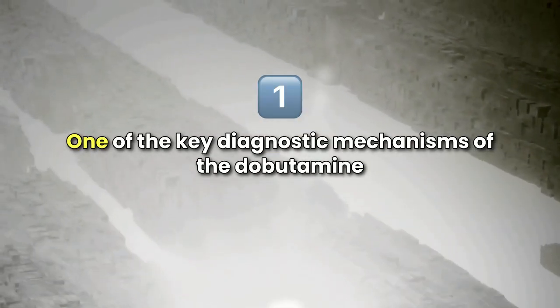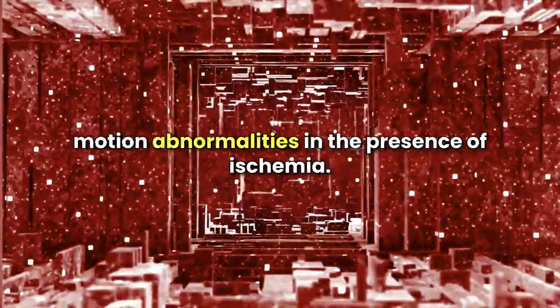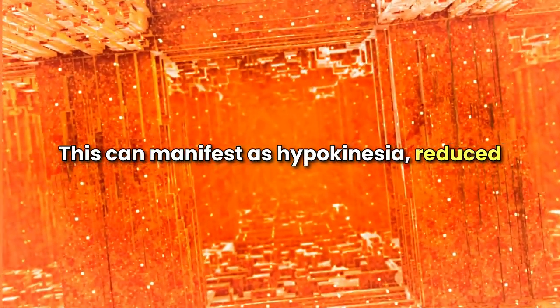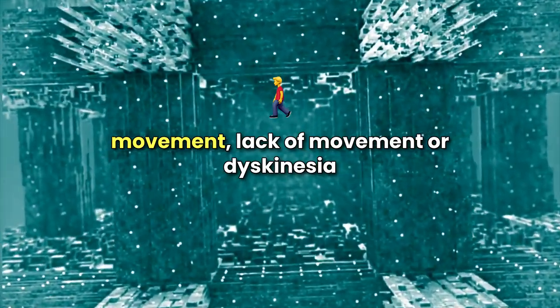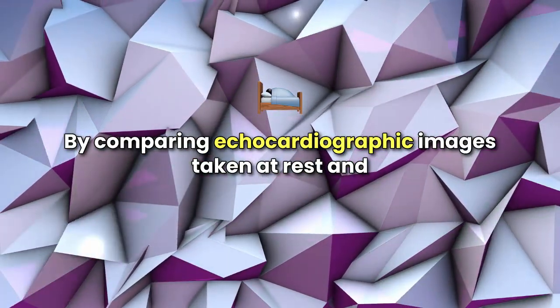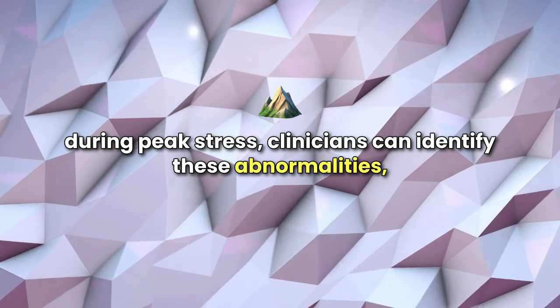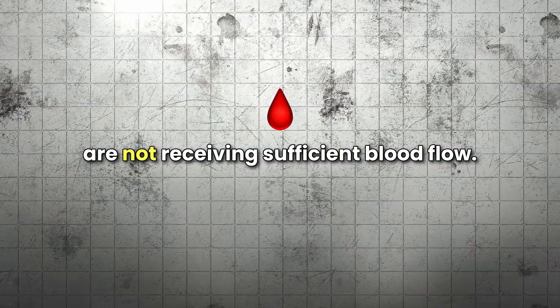One of the key diagnostic mechanisms of the dobutamine stress test is the detection of ischemia through wall motion abnormalities. In the presence of ischemia, certain areas of the heart muscle may not contract normally under stress. This can manifest as hypokinesia, reduced movement, akinesia, lack of movement, or dyskinesia, abnormal movement, in the affected regions. By comparing echocardiographic images taken at rest and during peak stress, clinicians can identify these abnormalities, which suggests that those areas of the myocardium are not receiving sufficient blood flow.